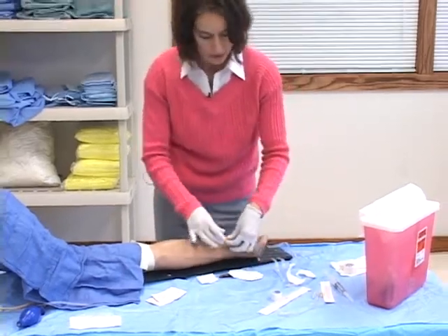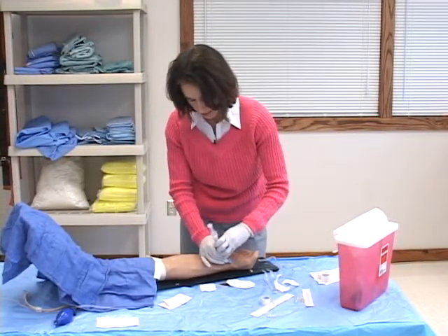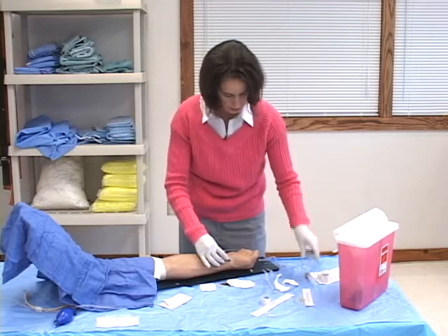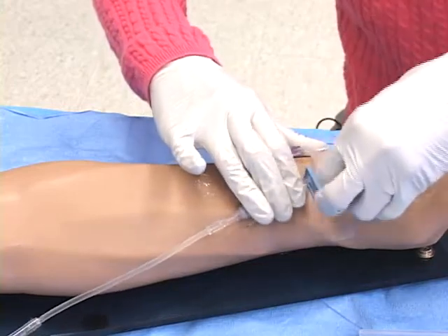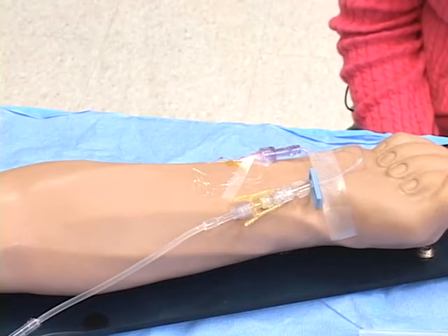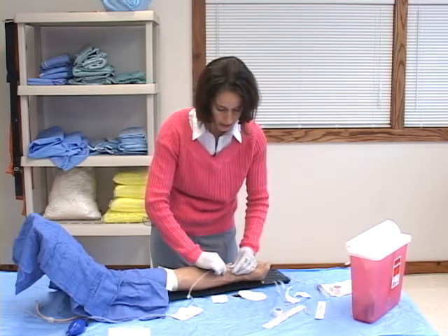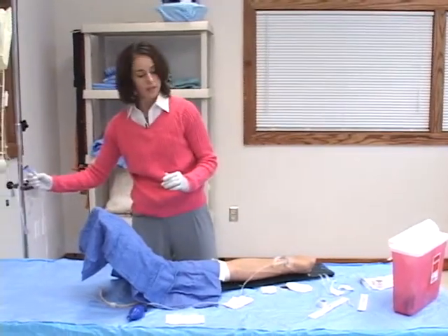So I have this secure, and then I'm going to take my saline flush, and I'm going to flush and make sure I can enter easily into the vein, and the saline goes in nicely. And I'm going to go ahead and take one of my larger pieces of tape and secure the connector so that the patient doesn't, with their other hand, try and pull out this IV. And then you already saw me flush this tubing to make sure I don't have any air bubbles in there. And then I'm going to connect with this little clamp. Then I'm going to roll this up to start my fluids going.